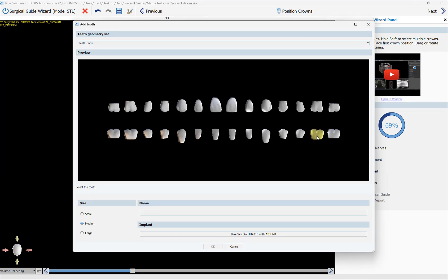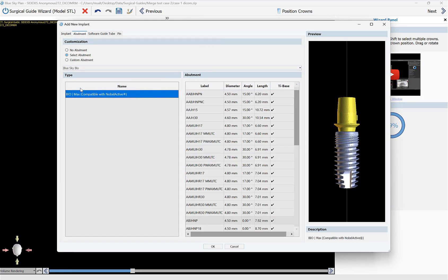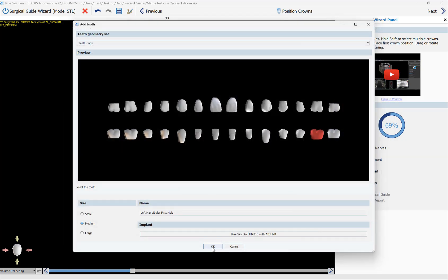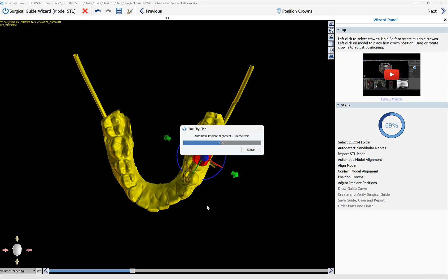We're going to select the relevant crown — a general size: small, medium, or large — and the relevant implant and abutment. We'll be able to resize the crown later on and swap out the implant or abutment for a different size. I'm going to click on Implant, select the relevant implant, then switch over to Abutment, select the relevant abutment, and then click OK and OK again.